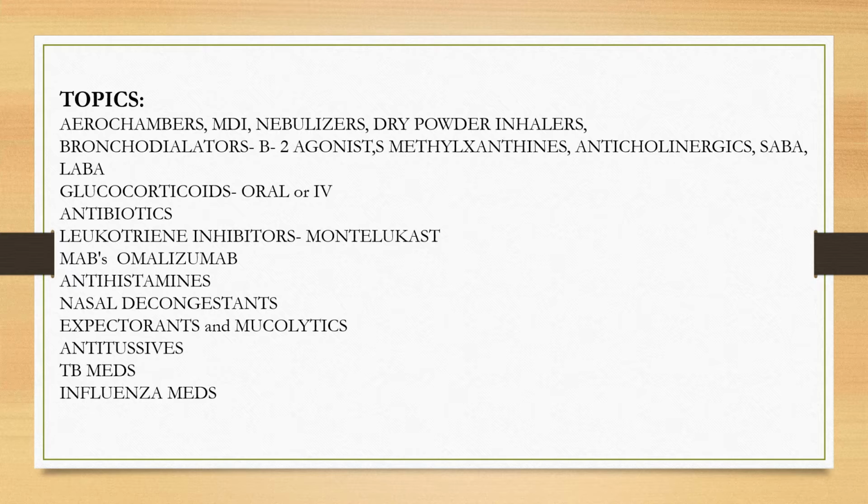Okay. There's also dry powder inhalers. So instead of MDIs, which are basically puffers, there's dry powder inhalers where you just twist the inhaler, and then there's a powder sitting in there that the person puts to their mouth and just inhales it. Okay, so they're also available. So, for example, you wouldn't need an aero chamber with a dry powder inhaler.